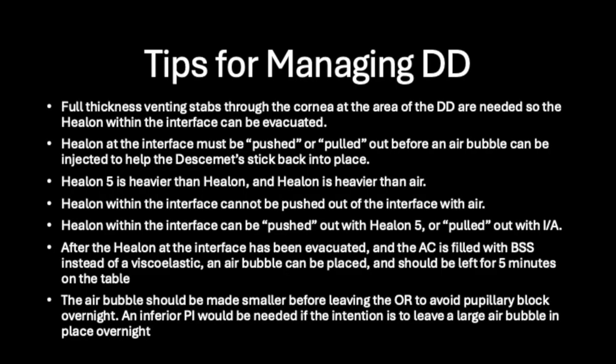In summary, if you encounter an intraoperative Descemet's detachment, remember to make full-thickness venting stabs through the cornea at the area of the detachment so the helon at the interface can be evacuated. All viscoelastic at the interface must be pushed or pulled out before an air bubble can be injected into the AC to help the Descemet's stick back into place. Healon 5 is heavier than helon, and helon is heavier than air, so any helon trapped at the interface cannot be pushed out with just air. Helon can be pushed out of the interface with Healon 5 or pulled out of the interface with IA.